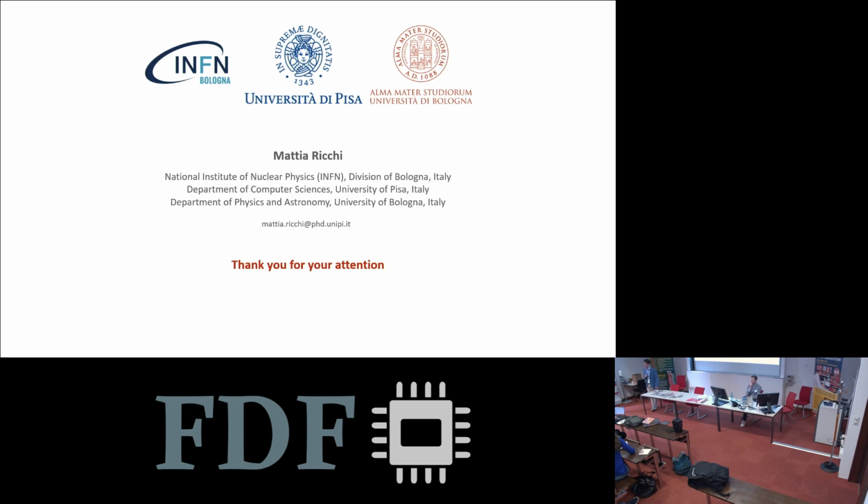Another reason is what kind of application you are really looking at, because with MRI there is supervised training, and where's the ground truth? We use simulated data. We simulated it, so we have the actual value that we would get from the MRI scanner, and we know what the target value is. So we compute our ground truth values. So the training is still offline, in a sense? At this stage, yes. Once we have tested this and seen that it works, we will use real data.